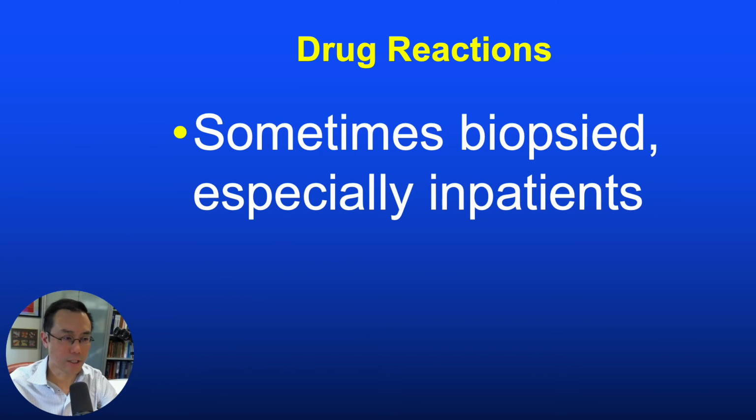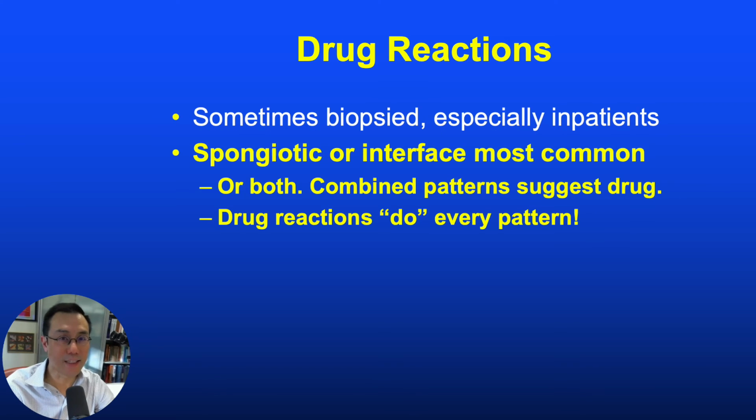Although most drug reactions are not biopsied, in my experience, drug reactions are frequently biopsied, especially in hospital inpatients. I always tell my colleagues and trainees that drug reactions can do anything. So drug reactions can mimic any of the standard patterns of inflammatory skin diseases. But having said that, probably either spongiotic dermatitis or interface dermatitis are most commonly encountered. And most distinctively, the combination of patterns, so a spongiotic and interface pattern or any kind of combined pattern that doesn't really fit other known inflammatory skin diseases, generally is a clue to the possibility of a drug reaction.